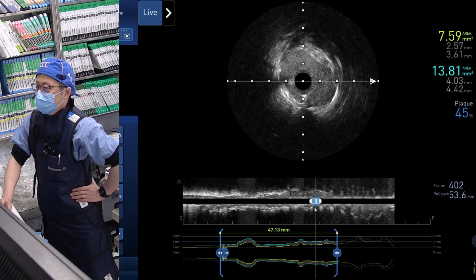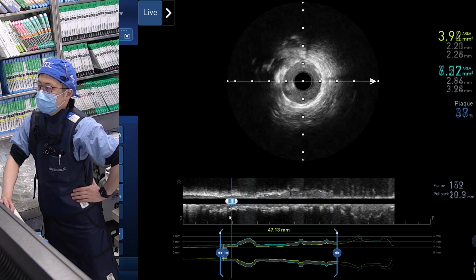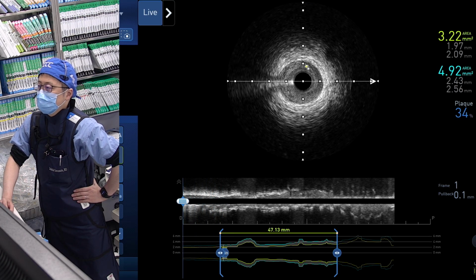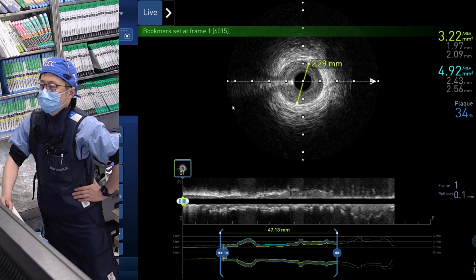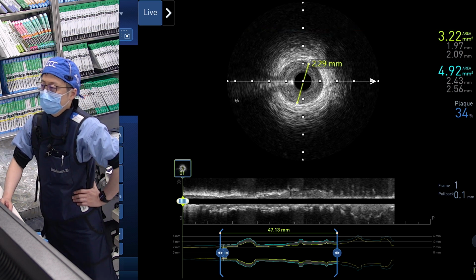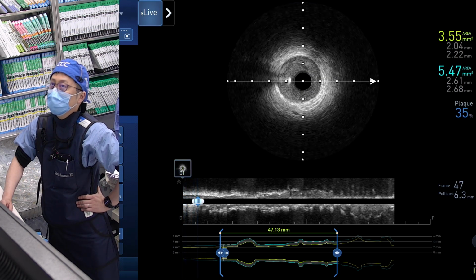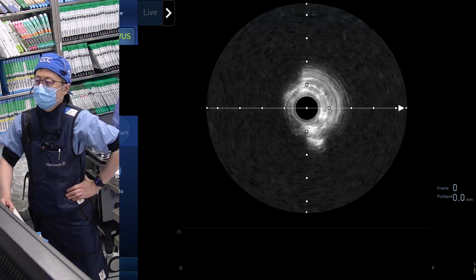The question that comes here is America versus outside. Outside, everybody will put a drug-coated balloon. Should we do a drug-coated balloon now? That's the key. I'm doing the side branch IVUS because Kiski always likes side branch IVUS. But I went to 20 atmospheres at the ostium with a high-pressure balloon, to make sure the ostium looks good.